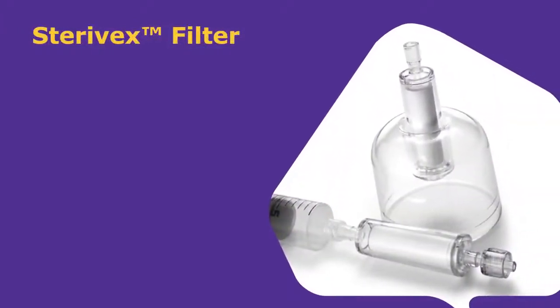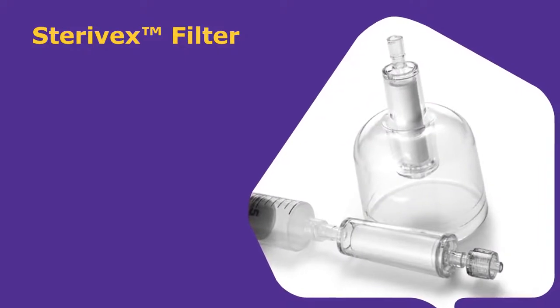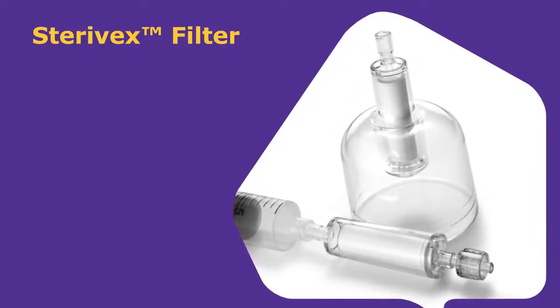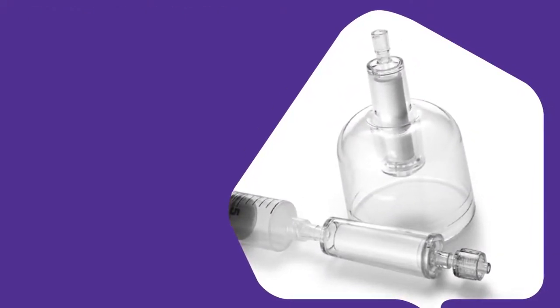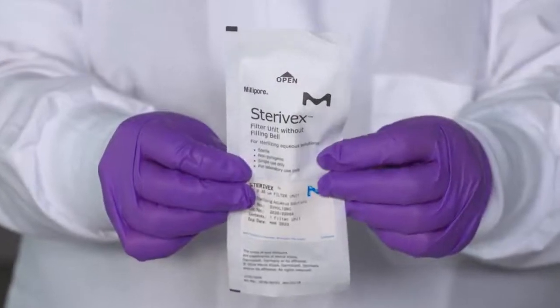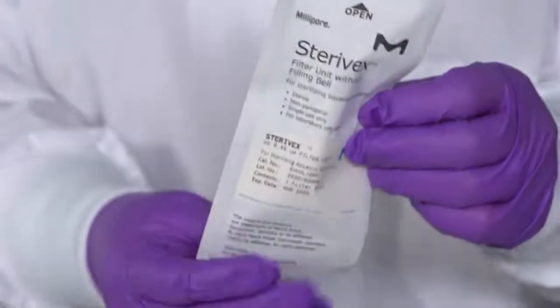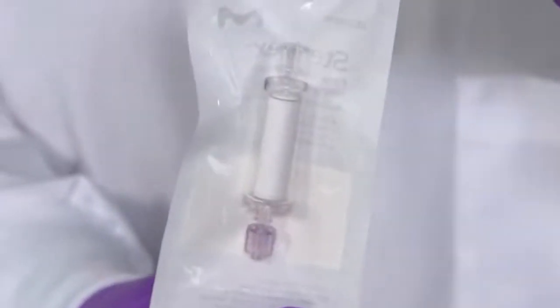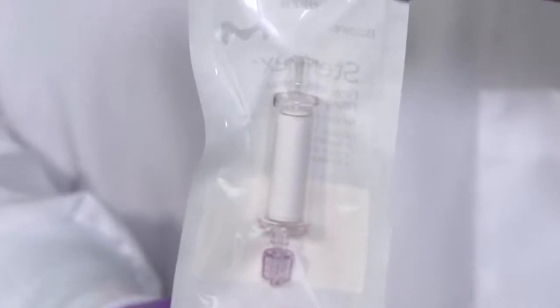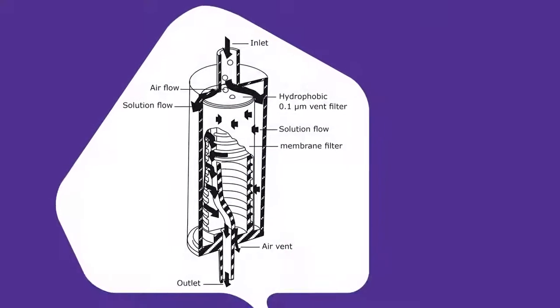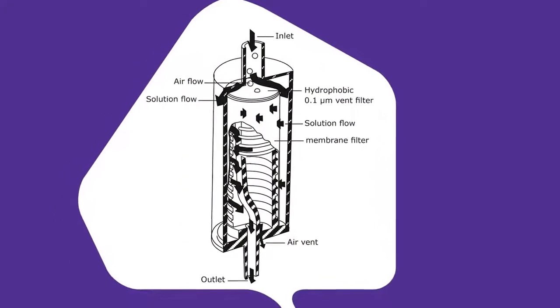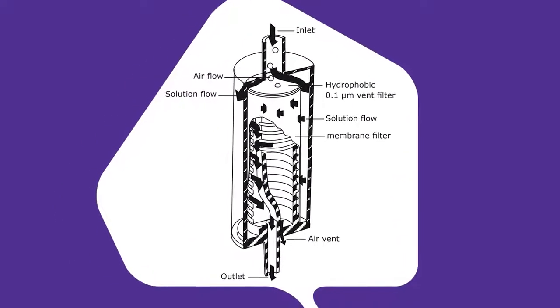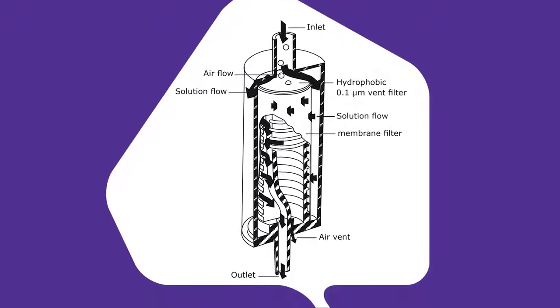Using a 0.2 micron sterilizing grade Sterivex GP, GV, or for clarification, use the 0.45 micron HV filter units for large volumes up to 1 liter. These compact design filter devices are single use and boast an impressive 10 square centimeter filter area that is wrapped around a center core. It also features a vent filter to prevent air locking.